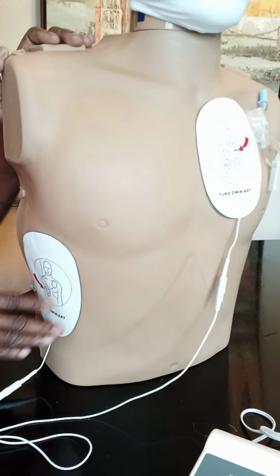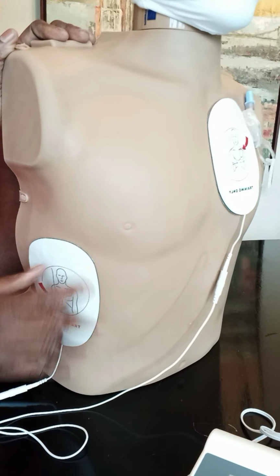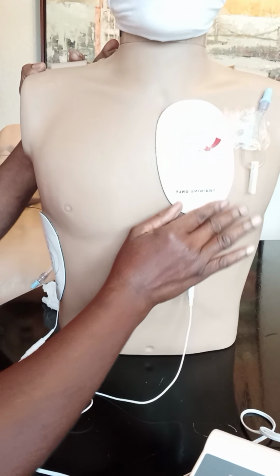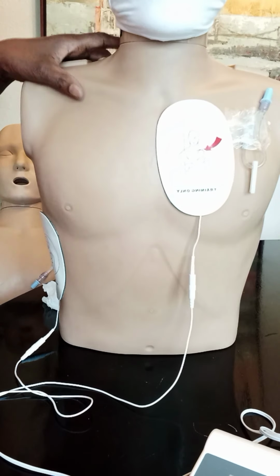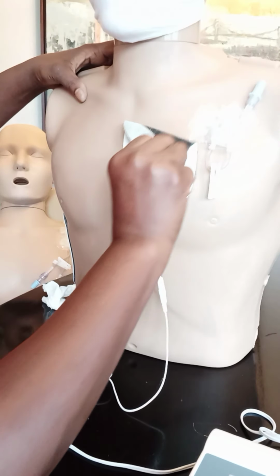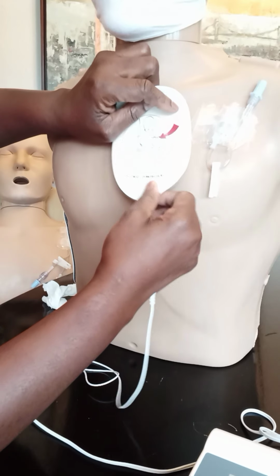So you place your pad here on the left side, because that's where this belongs, where the medicine patch was. I cleaned it off and I placed it. And this is where Jerry is getting chemotherapy. We placed it on the side here, making sure that it's sticking to the skin. As a matter of fact, maybe a little bit on the tape. We want it to stick clearly on the skin, not on the tape, okay?